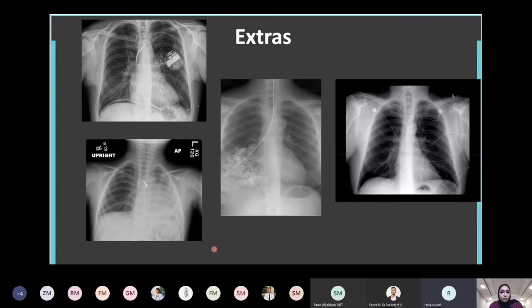Then on the second patient with the foreign body, can you please just point out the heart for us? So the clue here, yes, it's on the left, and we have the right and left markers. So we see that whiteness on the left hemithorax because of the heart. So basically the heart is most of that whiteness that we can see. I don't know how to control this. Can you see my arrow? No. Right, okay. So basically most of the whiteness that you can see filling the left side space is the heart. Why? Because there's volume loss. Because of this foreign body, the air is not going into the left lung, and the left lung is mostly collapsed, and the heart is shifted all the way to the left, and the right lung is seen bigger because it's hyperinflated and the left lung is collapsed.